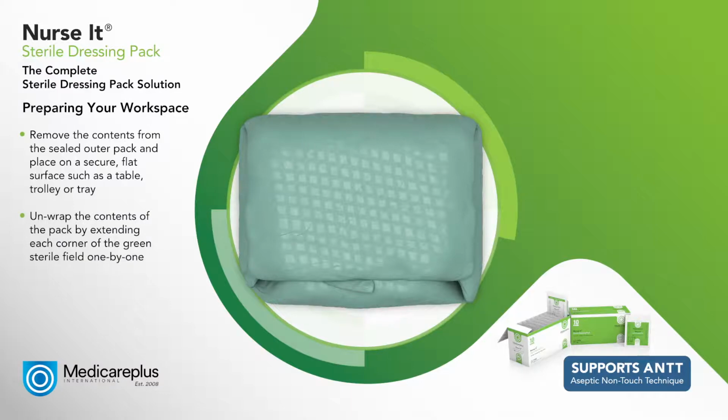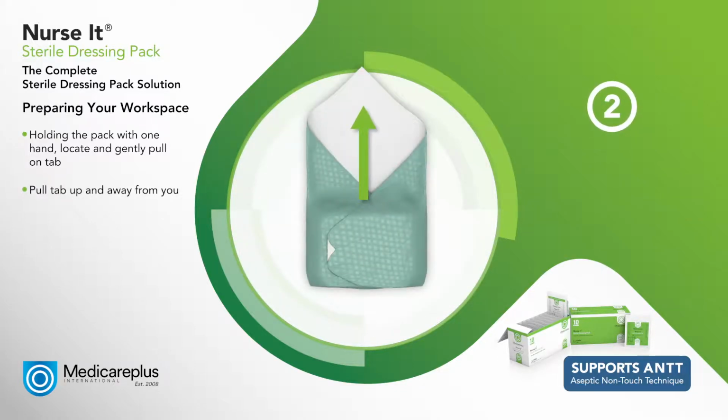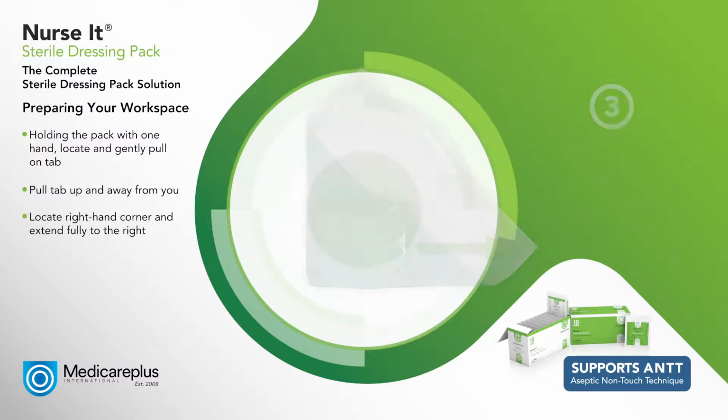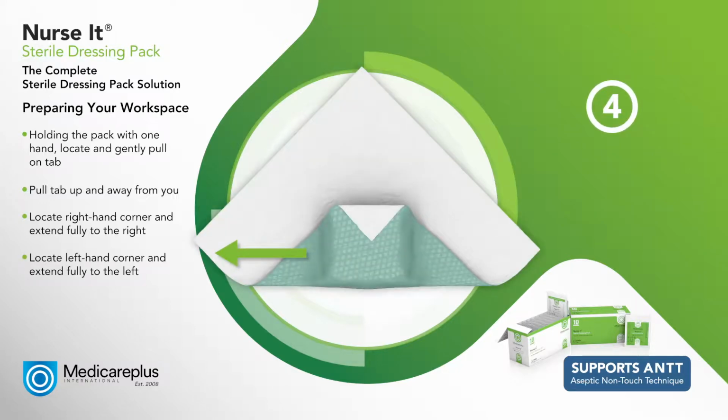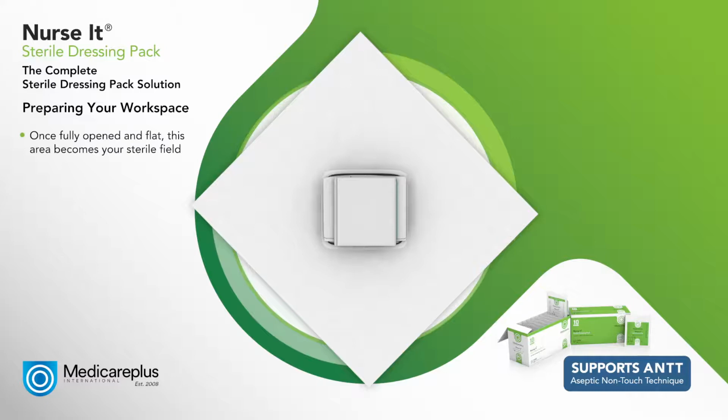Then, unwrap the contents of the pack by extending each corner of the green sterile field one by one. Follow the steps in this simple guide, starting with the visible corner tab as indicated here. Holding the pack with one hand, locate and gently pull on the tab. Pull the tab up and away from you. Then locate the right hand corner and extend this fully to the right. Next, locate the left hand corner and extend this fully to the left. And finally, locate the fourth corner and extend this fully towards you. Once fully opened and flat, this area becomes your sterile field.